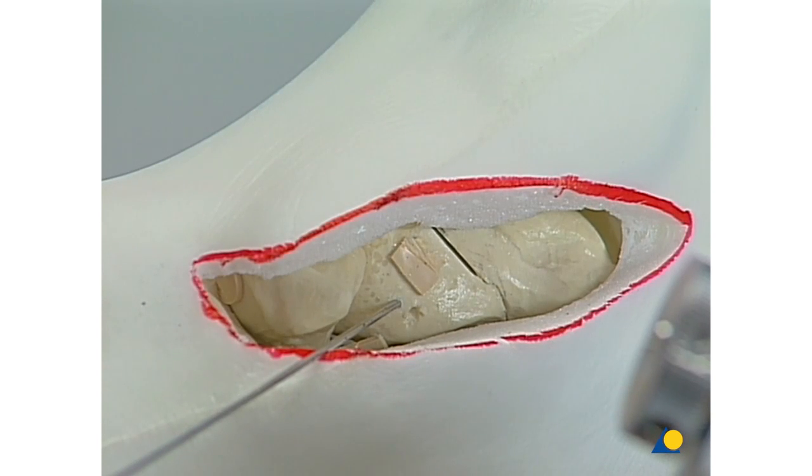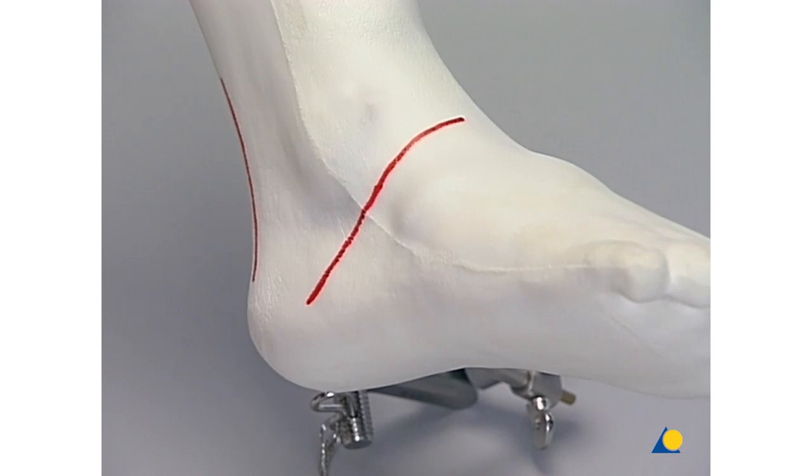And the lateral aspect of the foot is considered for the anterolateral approach. This approach begins on the dorsum of the foot and goes obliquely below and anterior to the lateral malleolus towards the heel.